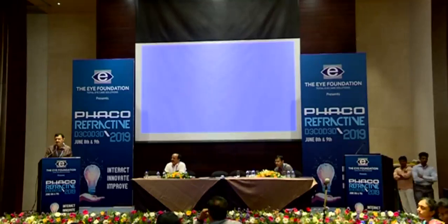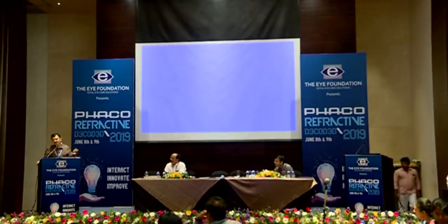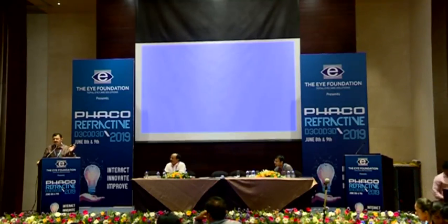Sir, in case we have to explant the lens, do we have to extend the incision? See, you don't need to do anything. It's very easy. Just lift it, put a Healon in the anterior chamber. Don't use methylcellulose. Put Healon or sodium hyaluronate in the anterior chamber. Take a Sinskey hook, dilate the pupil, push it, one haptic, one footplate will come out. Just hold the footplate with a good forceps.